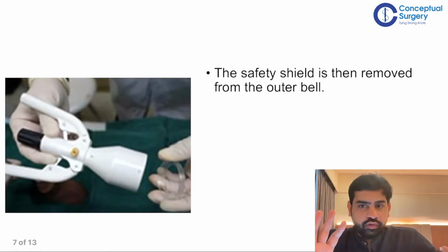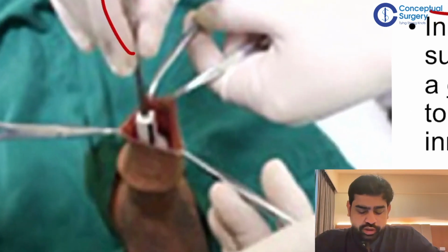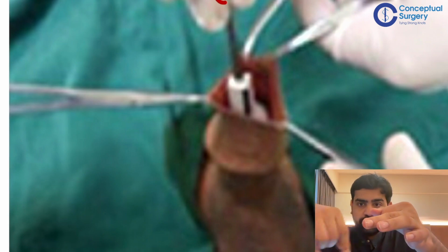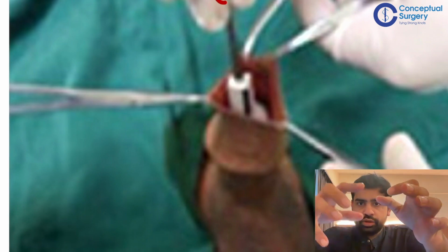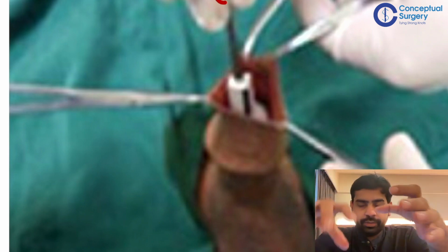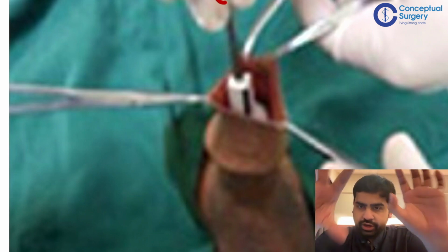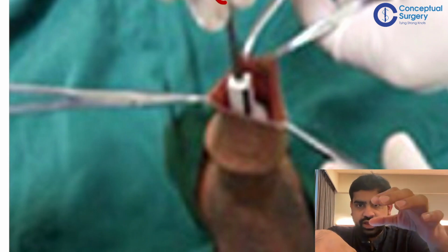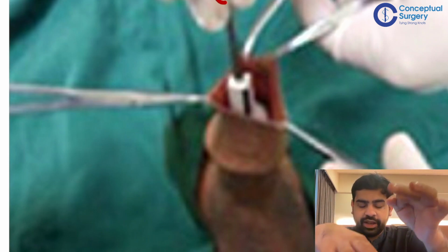Now after you have placed this inner bell, you tie it. Whatever the prepuce skin is, you tie it very nicely to the inner bell. The metallic rod of this inner bell, you tie it. Understood? So the edge goes to the coronal sulcus, it protects the glans, and then you tie the skin over that metallic rod.